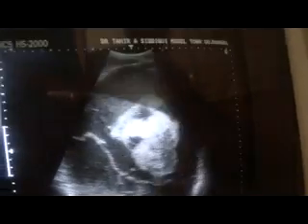And from here now I am just above the suprapubic region, angling the probe towards the patient's head region, and this is the total cystic area that can be seen in one view. It cannot be seen in total. It's such a big mass, it cannot be seen in total in any one view.